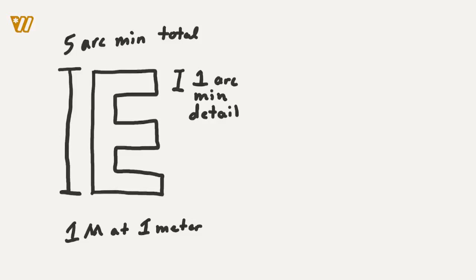It's got a detail of 1 arc minute. So that's going to be the MAR, the minimal angle of resolution, which would be 1. Each one of these individual bars on the E has 1 arc minute of detail for us to be able to see.